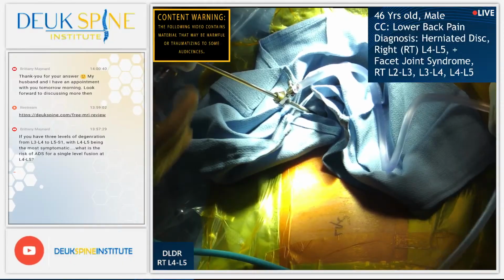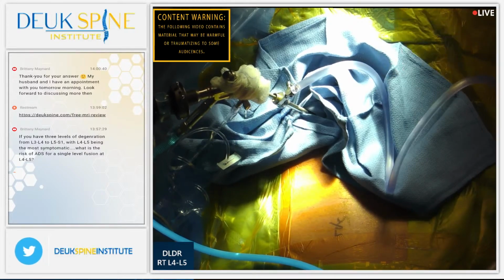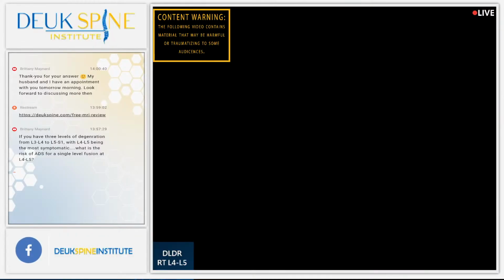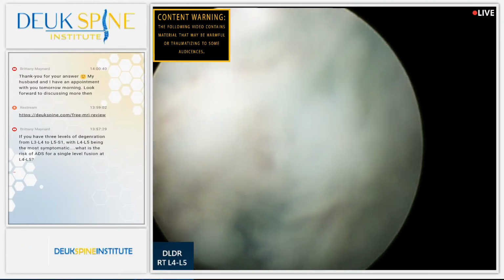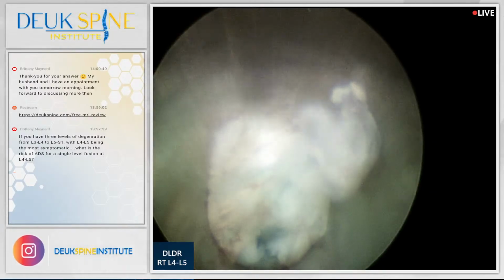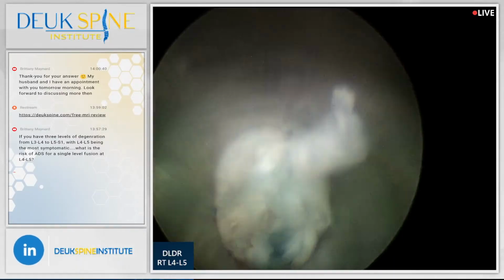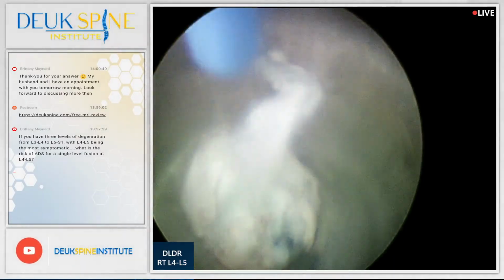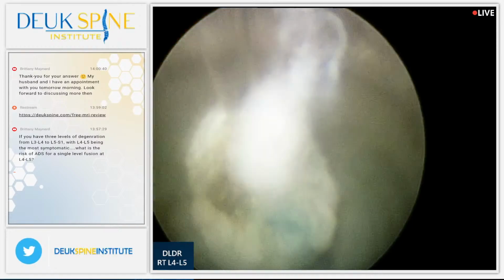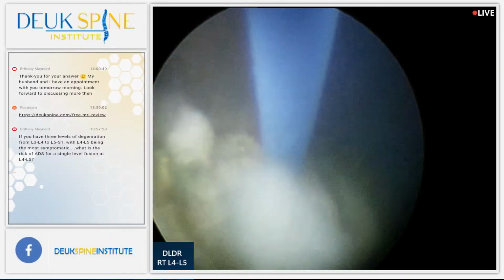Well, Henry, let's show the audience how we repair herniated discs like this. All right, laser. You guys see the inflammation on the outside of the annulus right there? Yes, we do. That is the source of his pain right there. You see the blue? The blue is degenerated nucleus pulposus. It's bulging out, pushing the annulus, and you've got inflammatory tissue right there on the annulus. So you're basically looking at a disc zit. A disc zit. A zit full of inflammation, but it's not a zit, it's a disc. A disc that's injured. This is going to do wonders for him.